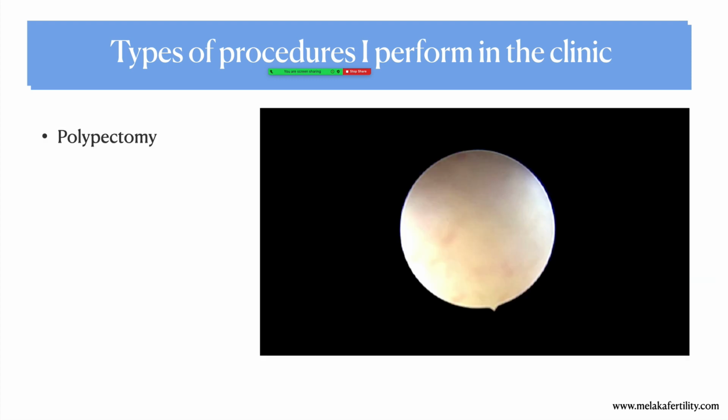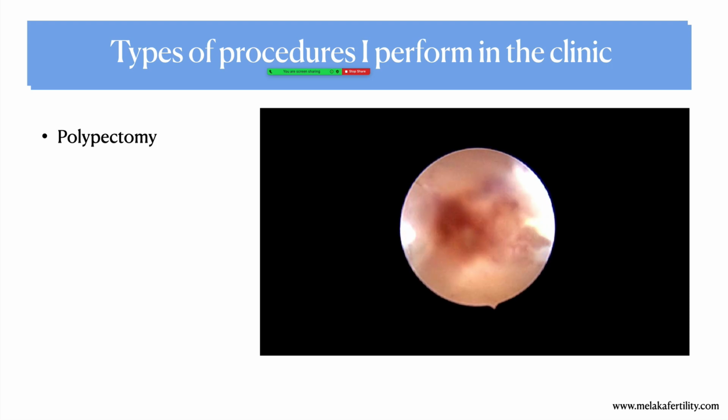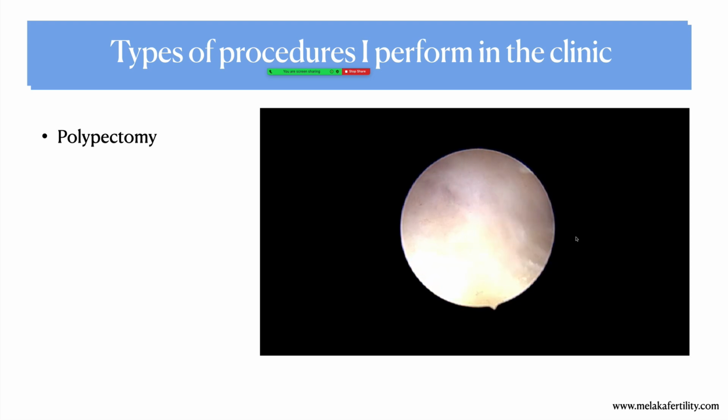So what are the other procedures? Polypectomy is a very common procedure that I do in the office. I think all of you do as well. Polyps can be of different sizes. I showed a polyp that I removed just now, and this particular case, which we did a few days ago, was also removed in the office setup.